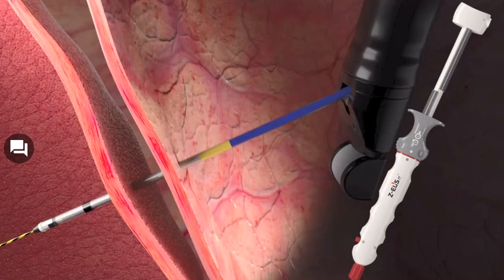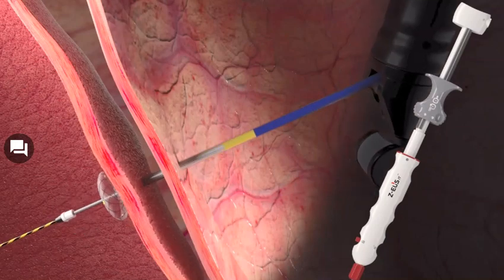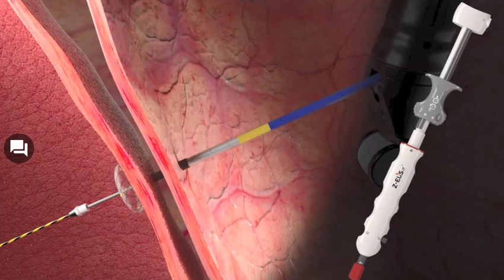Step 2. Stent deployment. To deploy the distal flange, rotate the spin lock 180 degrees. Deployment is ready when you see odd numbers of stent deployment indicators. Push it upwards until you feel a click. Pull the endoscope back slightly to the wall. Make sure the black marker is visible under the endoscopic view. If the black marker is not visible, unlock the sheath lock and slide the sheath handle 2 to 3 millimeters upwards until the black marker is fully visible, and lock the sheath lock.